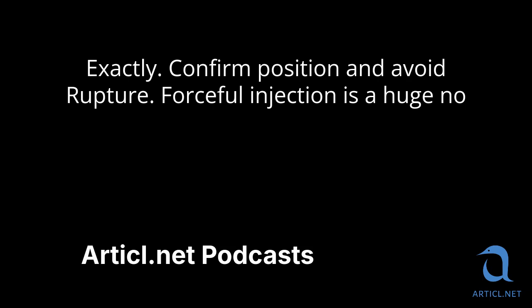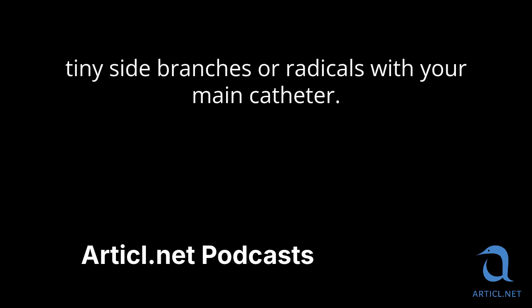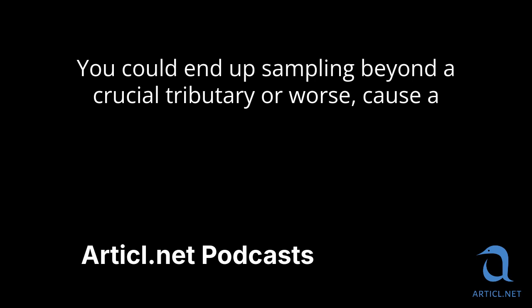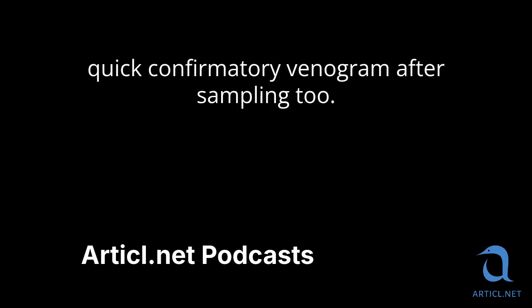Exactly. Confirm position and avoid rupture. Forceful injection is a huge no-no. These veins are fragile. Another key point, avoid cannulating too deeply into tiny side branches or radicals with your main catheter. Why's that? You could end up sampling beyond a crucial tributary, or worse, cause a rupture or a venous infarct. That can lead to false negatives. We usually do another quick confirmatory venogram after sampling, too.